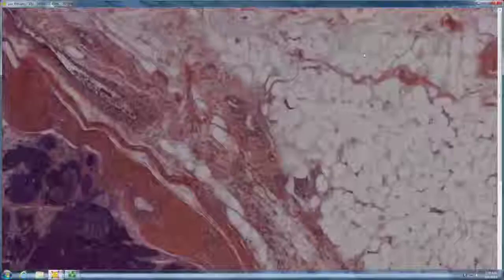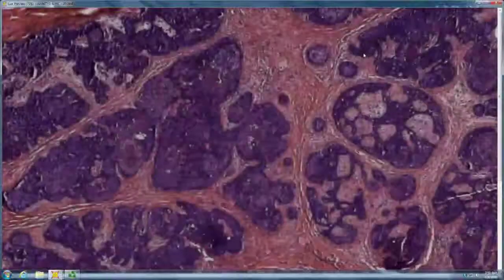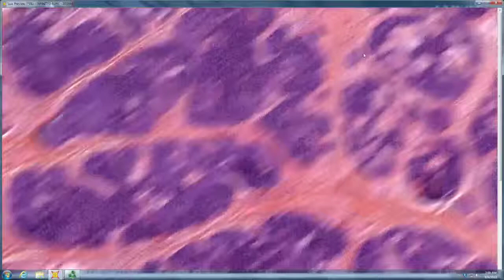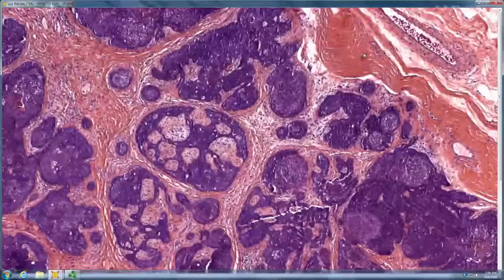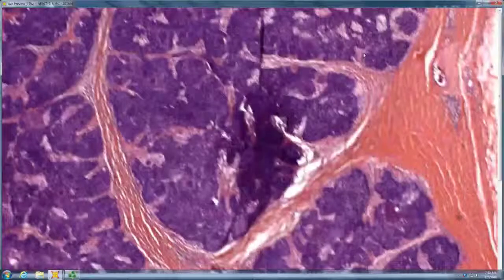The trichoblastoma, it's a little deeper blue. Yeah, so this is something that's deep, soft tissue, right? It's not in the dermis. And it is a big tumor composed of blue cells, but there's clefting in the stroma. There is a lace-like pattern.